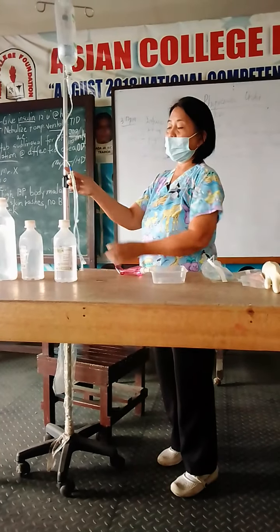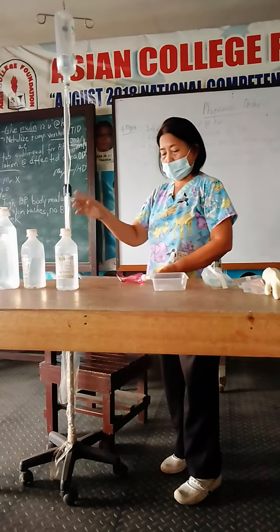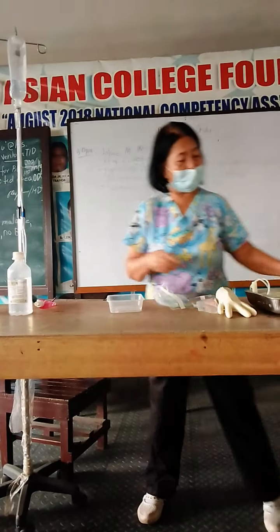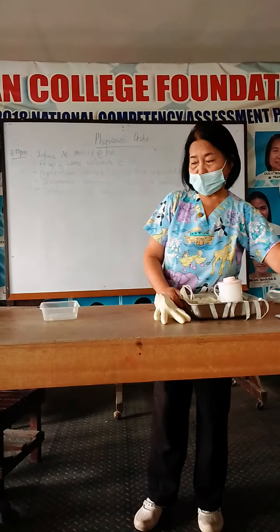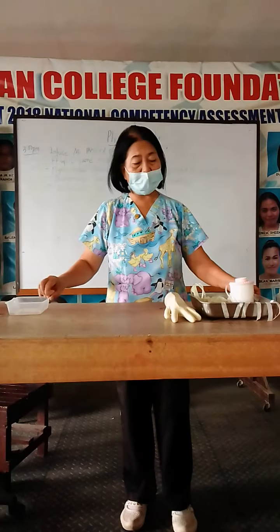Okay? See it? I just hook it back. And then I'm now ready to do insertion. So I will not be teaching you well with the insertion because somebody will teach you this.